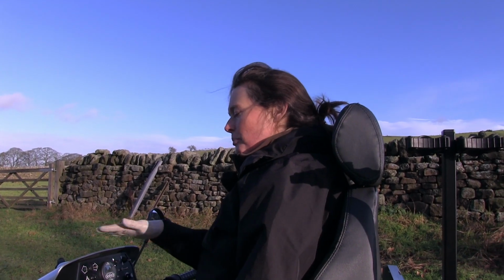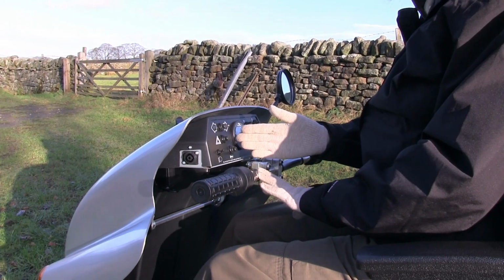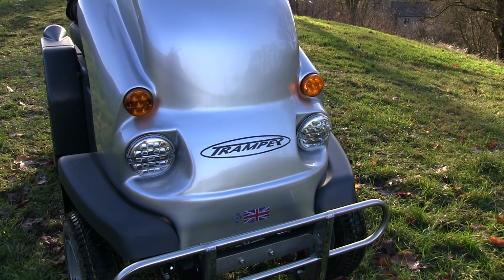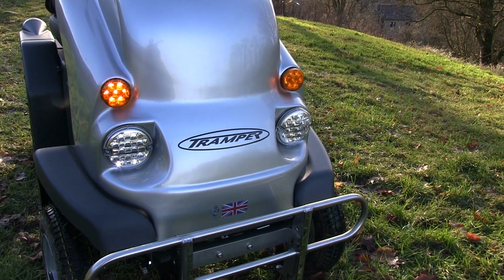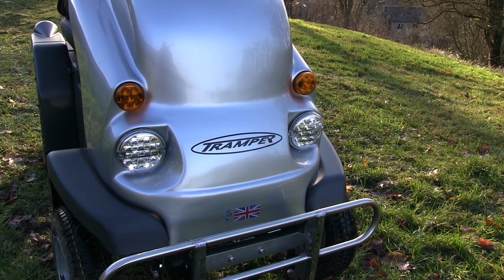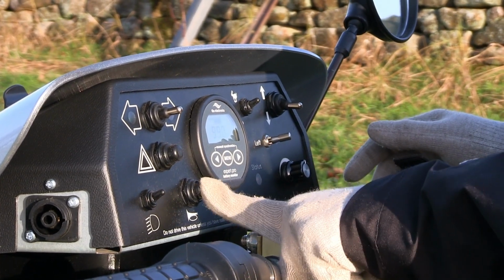On the Tramper we've got the dashboard, where on the left hand side we've got the controls which include the indicators, which are left and right. We've got hazard lights, which is just a button that you push that turns them on and off. You've got headlights, which in the up position is off, in the down position is on, and then the final part is the horn.